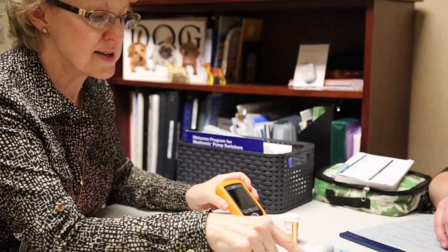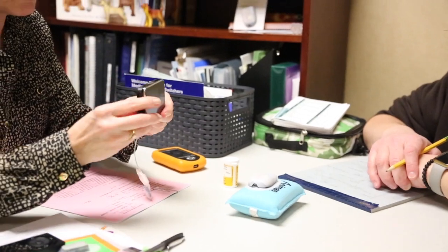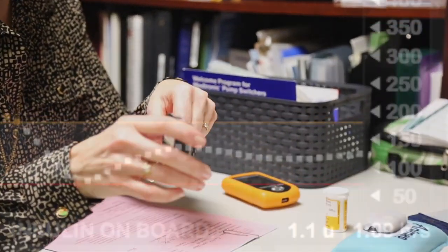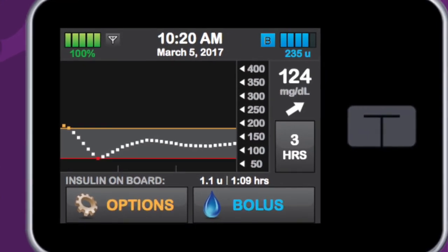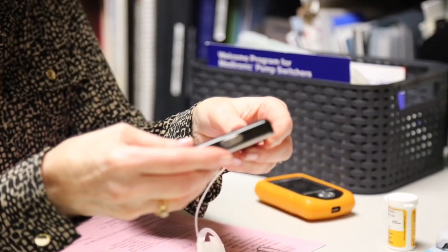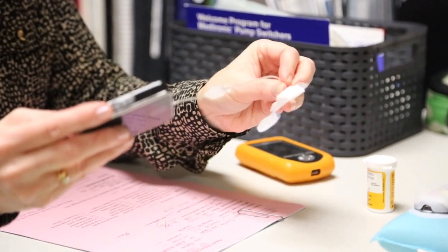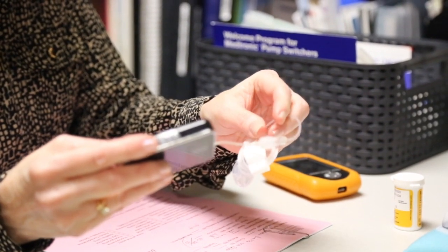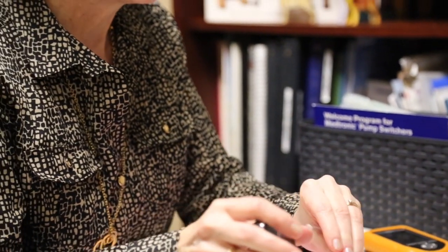We've been reading and discussing and researching, and I knew from our conversations you had been doing that. The pods last for 3 days. Right. It's a disposable pump. So with a regular pump, it starts out more expensive. It's thousands of dollars, but it will last for 4 years. Then with each 3 days, you would get a new cartridge, new tubing that goes in place. The every 3 day thing is cheaper on a traditional pump. Oh, I see. Than getting a pod.